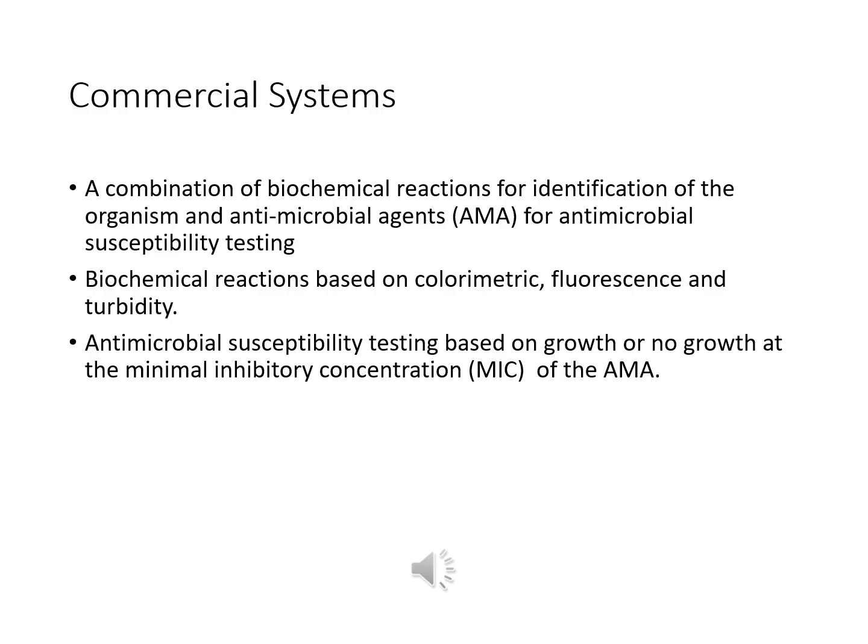What we report with the antimicrobial susceptibility testing is referred to as a minimal inhibitory concentration, or an MIC. The minimum concentration of that drug that will inhibit, not necessarily kill, but inhibit the replication of that organism. And then from there, we'll give that report to the physician, who will then be able to know what to prescribe for their patient, which will help get rid of their disease or infection.